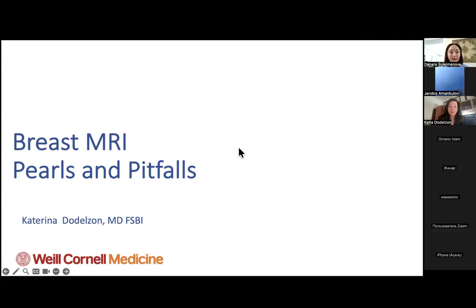So today's lecture is actually focusing, as was introduced, on pearls and pitfalls of breast MRI, in particular, really getting into the details of breast MRI interpretation. I'm going to weave in some common challenges in interpreting breast MRI, but also the brand new BI-RADS lexicon that was just released, actually now called a manual because it is so big, no longer an atlas. And this is the 6th edition. It was published in December of 2025.